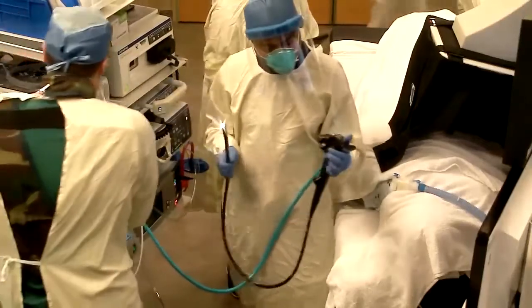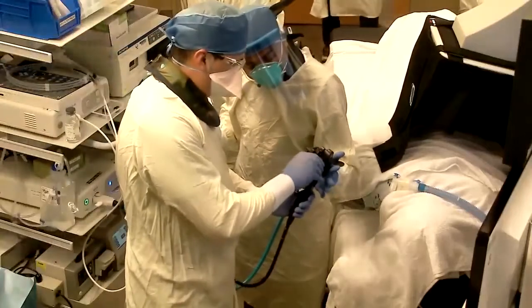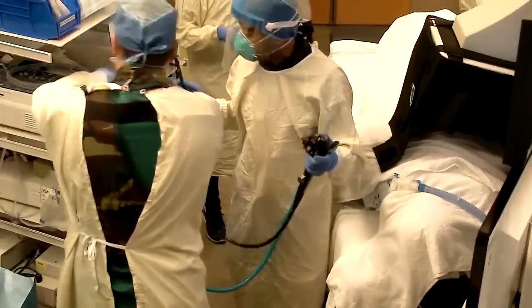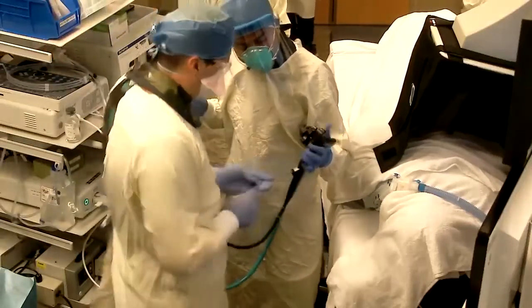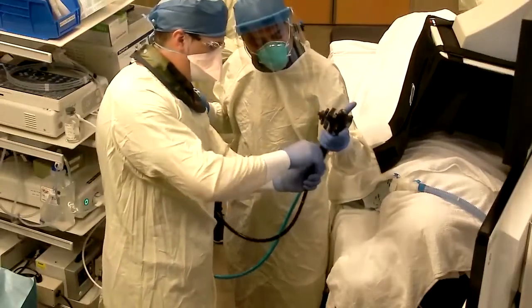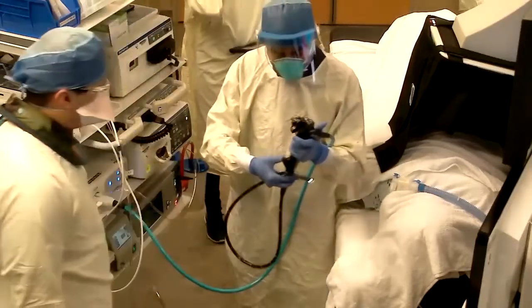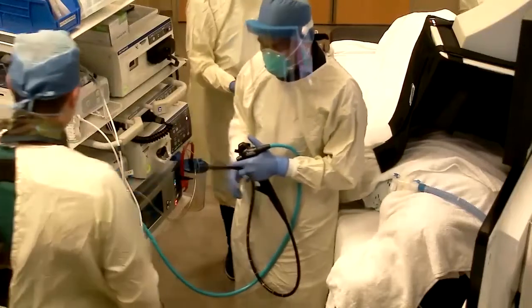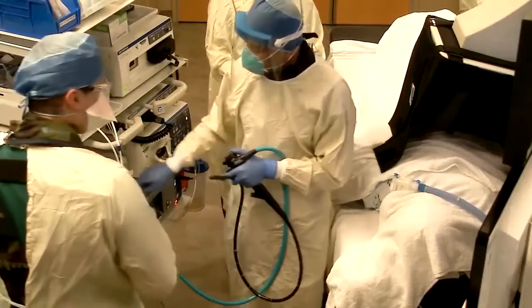Now what Enrique is going to do is he is going to put the caps to the system. It's very important to make sure that it is very tight and snug. The second is going to be the blue cap going into the water channel. That's done. And once that is done, we're going to now affix the suction cap, which should be put in, and then it should be turned around to be very tight. Once that is done, we're going to switch on. It takes about 20 seconds for the lights to come on.